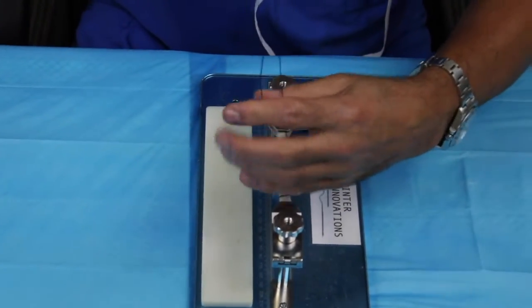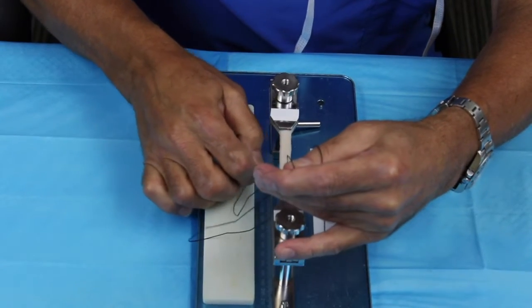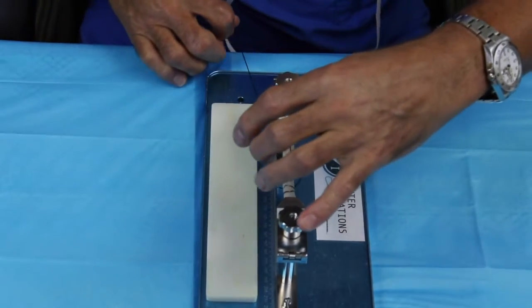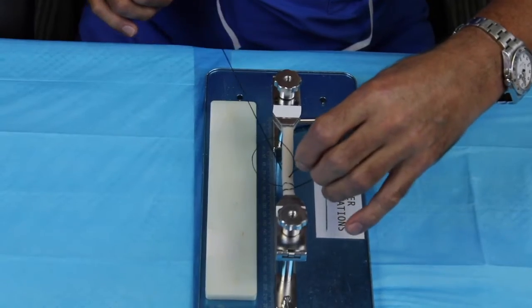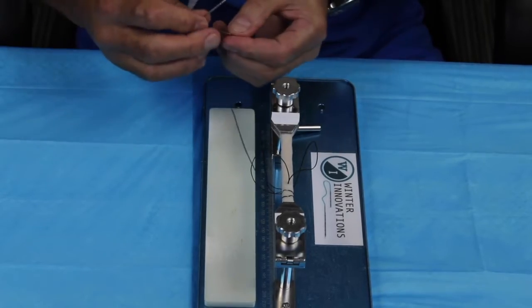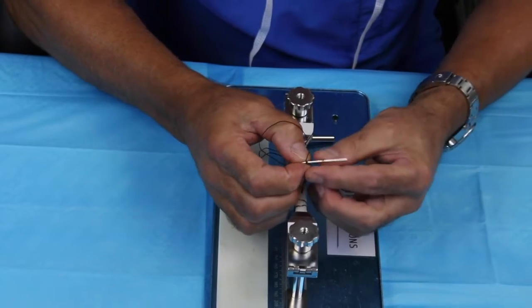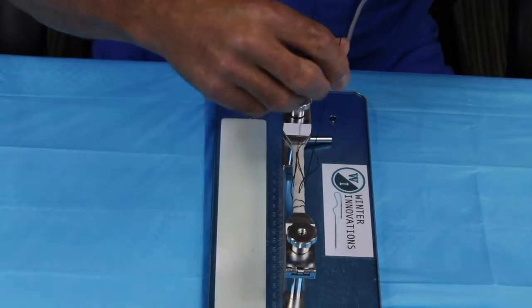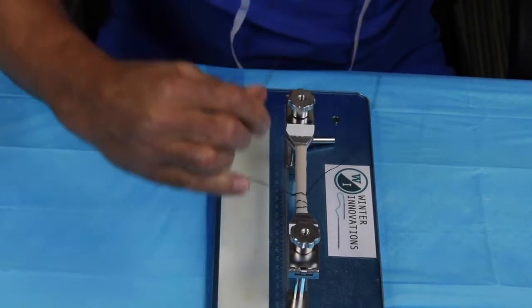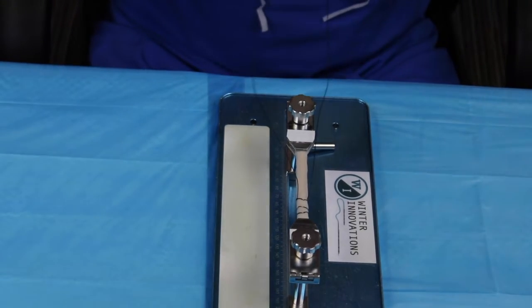And the way you do it is you lift it up again, you put it through, and you don't tighten it down the whole way. So you just leave this here, and you leave the 2 little figure of 8 loops there, and you take both ends of the needle, take it underneath, pull it through like so. And now what you're doing is you're creating this locking stitch, and you slide it down easily, and now you can tension both sides. And when I do the next one, you'll see, your distribution of the force is going to change.